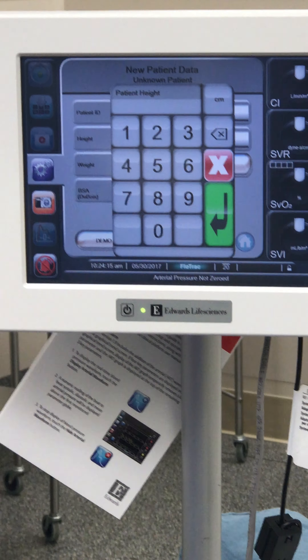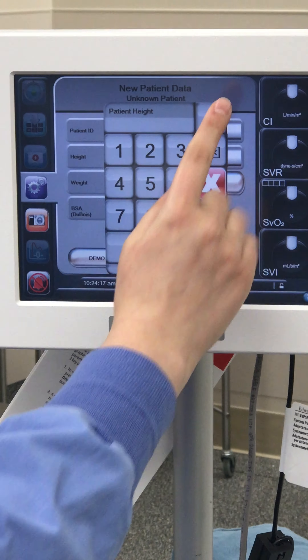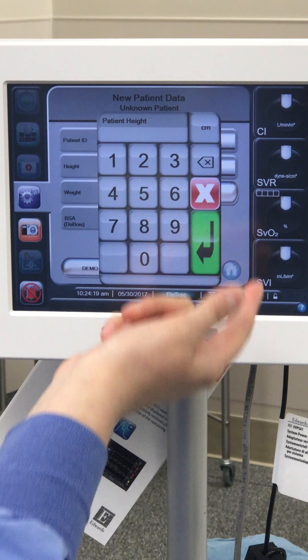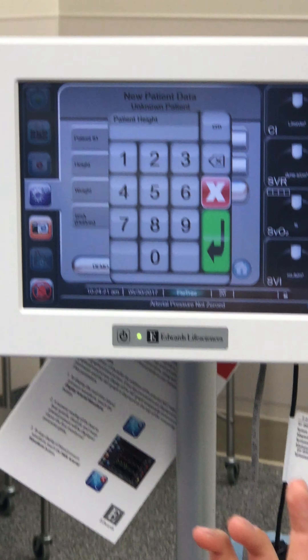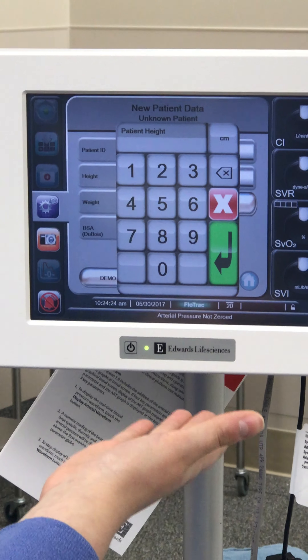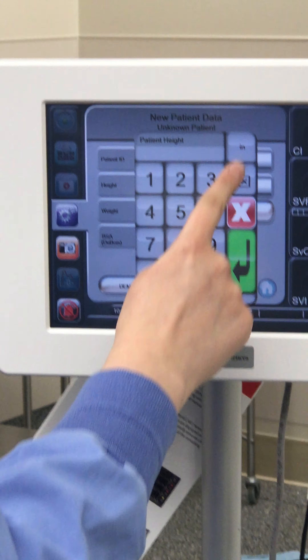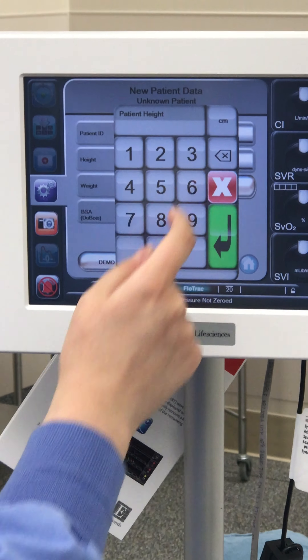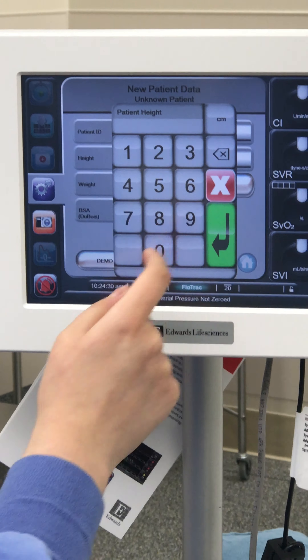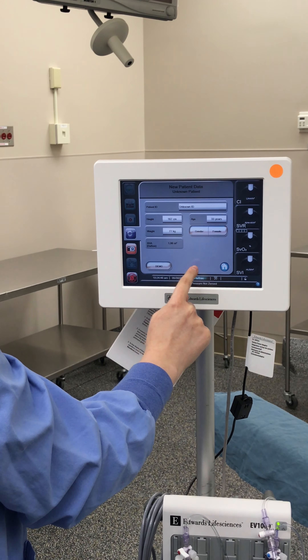It's touch screen, so it comes up with a keypad. Centimeters or inches — typically we get our information in metric, so we're going to stick with centimeters, but you can switch to inches if that's the information you have. We'll put in height, same thing with the weight in kilograms or pounds. We'll put in the age of our patient, and then male, female, or gender.